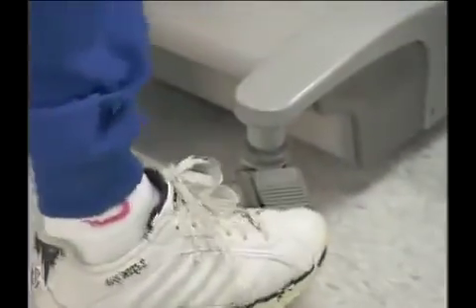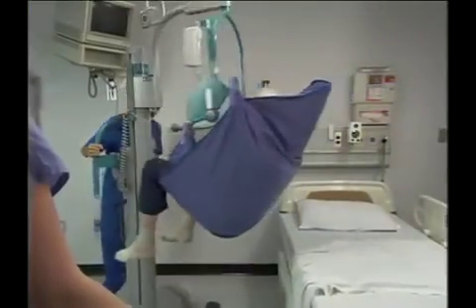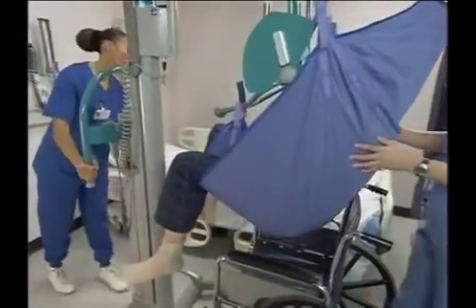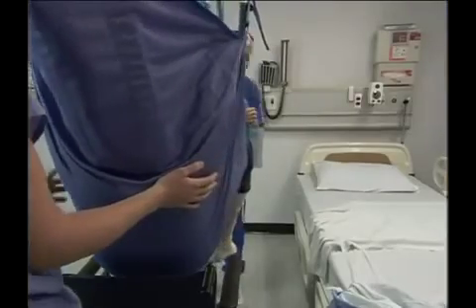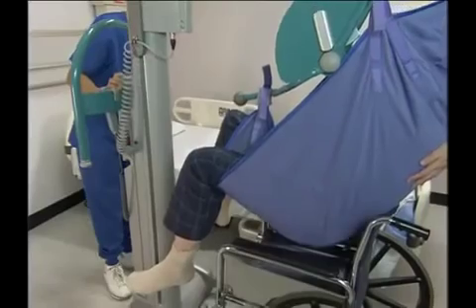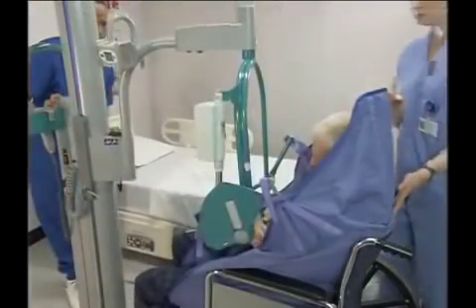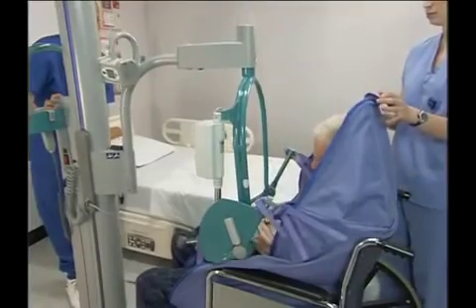Next, unlock the wheels of the lift and move the lift so the person is over the seat of the wheelchair. Spread the legs of the lift apart as necessary in order to straddle the wheelchair. The person's back should face toward the wheelchair. Next, gently lower the person into the wheelchair. Make sure the person's buttocks are at the back of the chair.